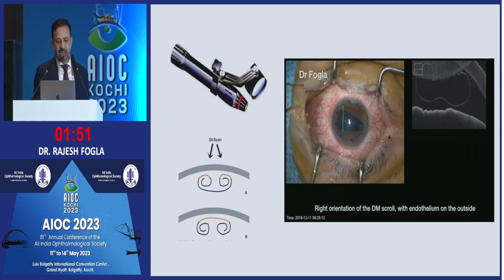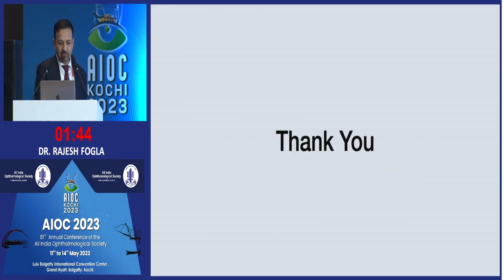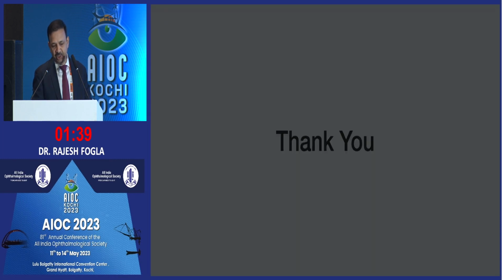You can use the handheld slit lamp or the intraop OCT, which Namrata will be talking about. So that's in conclusion about unfolding, loading, insertion, and unfolding of the DMEK graft. Thank you. Thank you for your patient hearing.